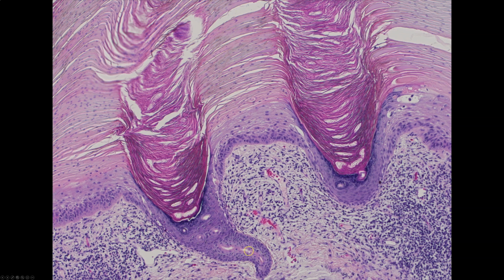And so you can see that sweat duct coming out with its pink cuticle lining, spiraling through the surface, and then up into the stratum corneum. And this keratin here is normal, and everything around it is way thicker, and it has nuclei in it, which is parakeratosis. So that's all abnormal due to the actinic keratosis, but the actinic keratosis spares the sweat duct opening. Here's another one over here. So it's a nice feature to really highlight the appearance of the acrosyringia.